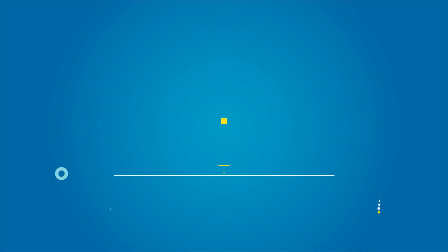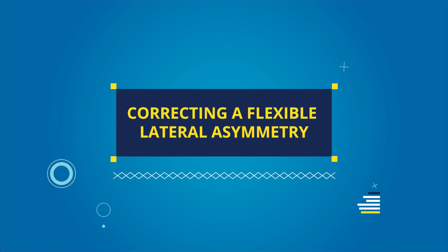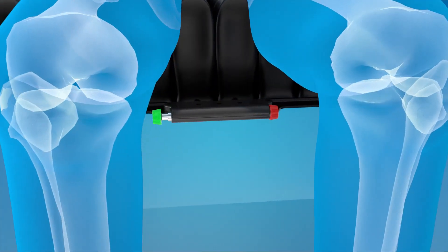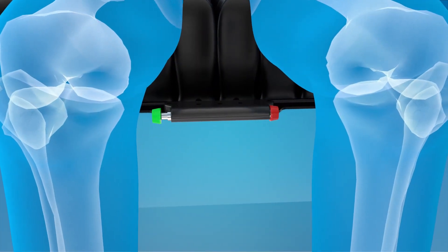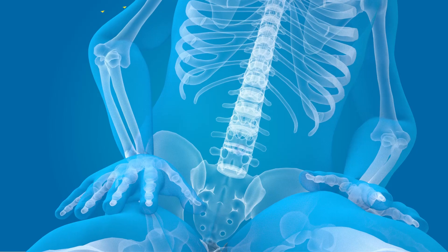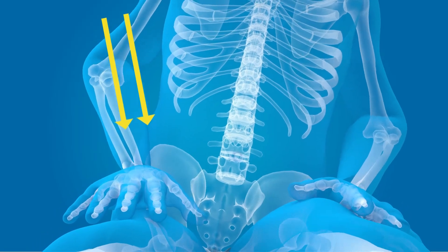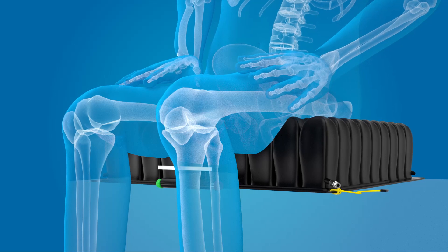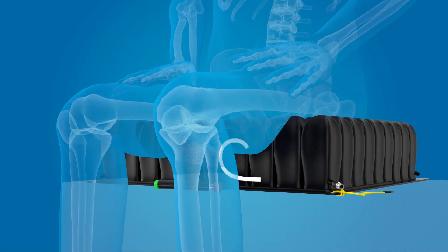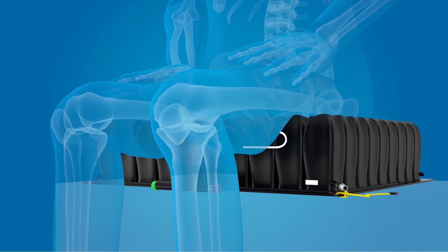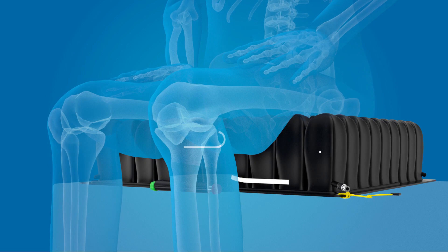To correct a flexible lateral asymmetry like a pelvic obliquity, make sure the isoflow control is open by pressing the green knob in. Press down on the higher side of the pelvis until the pelvis is level. This will force more air into the quadrant under the lower side of the pelvis and prevent it from tilting to that side.